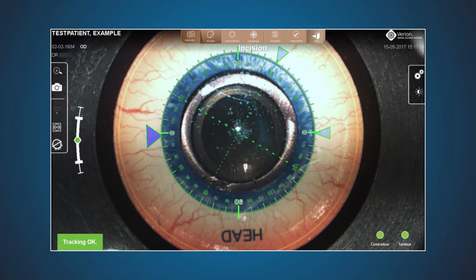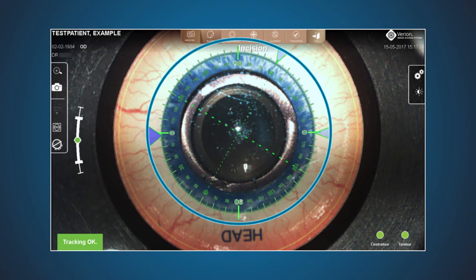Note that the surgical steps displayed correspond to the steps called for in the surgical plan. For example, if a toric IOL is called for, the toric IOL guide step will appear as a surgical guidance step. After confirming registration, you will see the incision step on the DMM screen. In the incision step, a tracking overlay of planned incision positions is shown on the microscope live image.